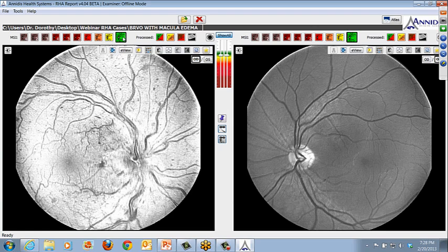So now, of course, he came back to me for an intraocular pressure check, and I had just put the instrument in my office, and I wanted to get some optic nerve baseline images with the MSI. I had already had some other optic nerve images, and much to my surprise, he was not complaining, had not noticed any vision change in his right eye, and he had stopped taking his eye pressure medication because he thought that it was irritating his eyes, and he didn't call me to tell me that. And this is what he comes in with.